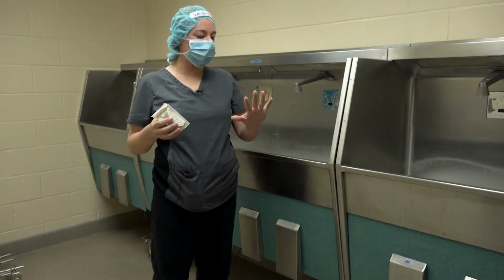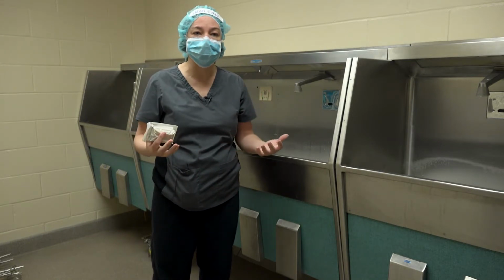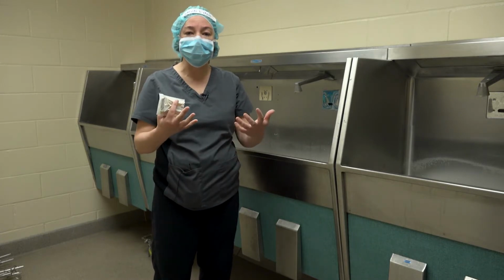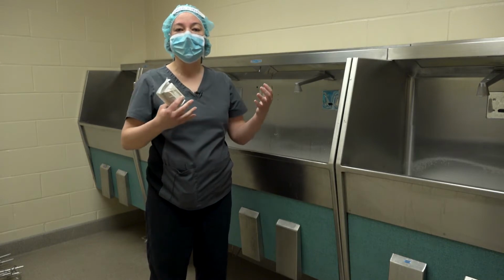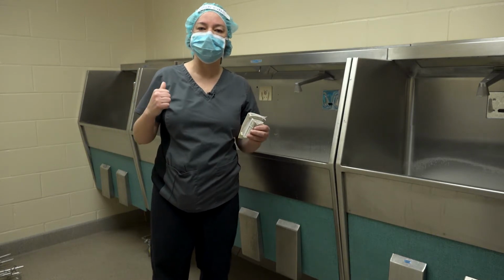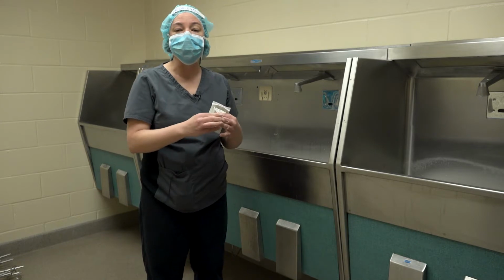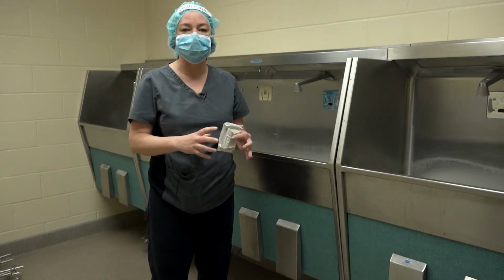Now the other thing to check before you get started is, do I have gross contamination of my hands? If you've been handling your cat and you've got blood and poop and urine all over your hands, you have to wash them first. This scrubbing is to make your hands aseptic. It's an aseptic prep, it is not a rough prep. So if you have crap on your hands or you did a whole bunch of gardening last night and changed your oil and you've got grease and gross stuff under your nails, you do that first. So you get all of that stuff off, all the gross contamination first.